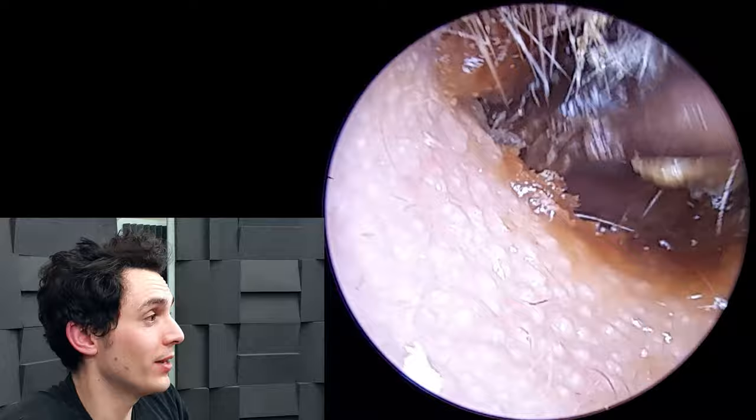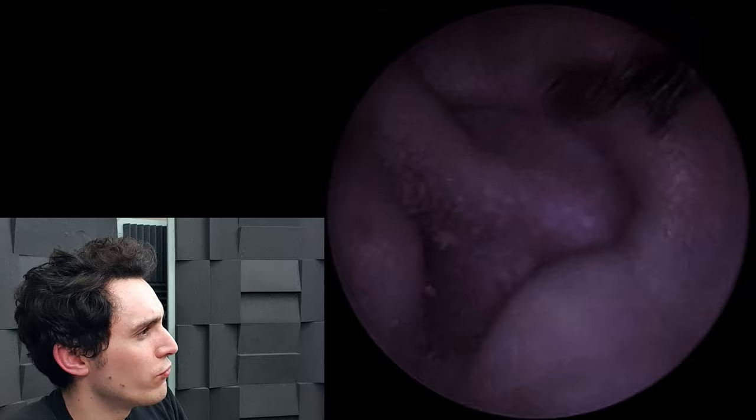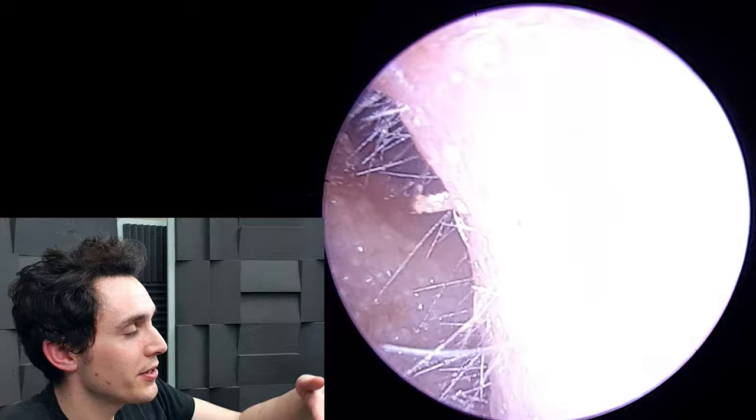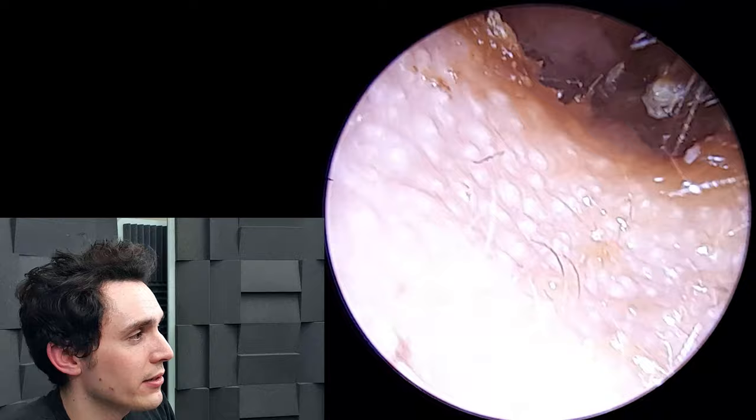The plug will unfortunately break in two, so it's not going to be one huge glorious boulder — but still a fair amount. Wriggling it out to get purchase on it — that's the first bit that's broken off. And this here is the main bit. It's quite interesting to see the underside where all the dead skin is. There we have it.